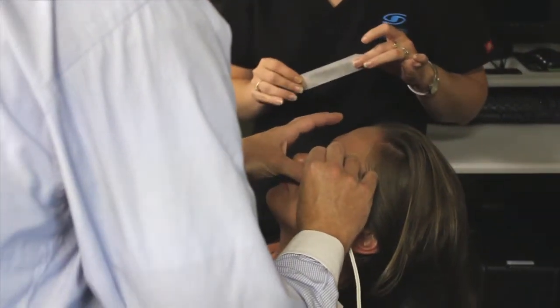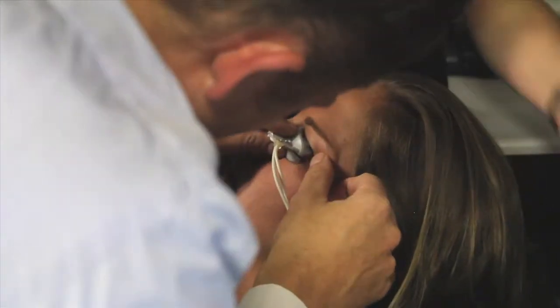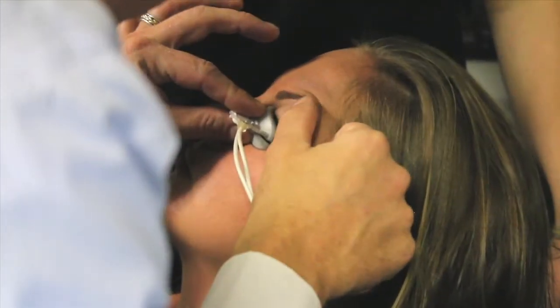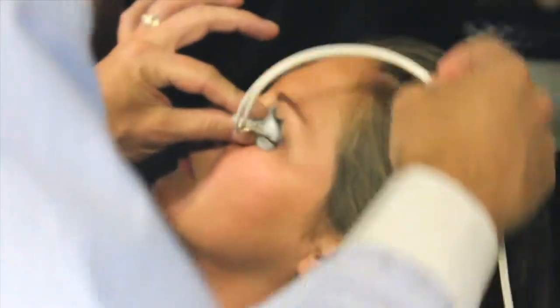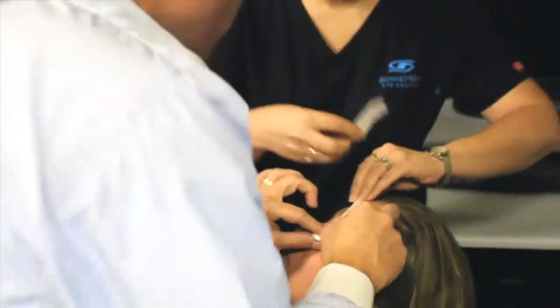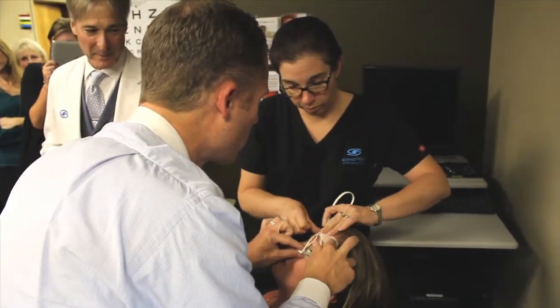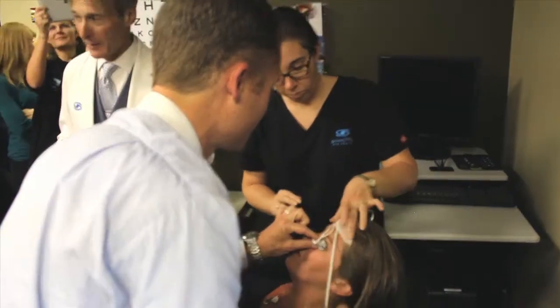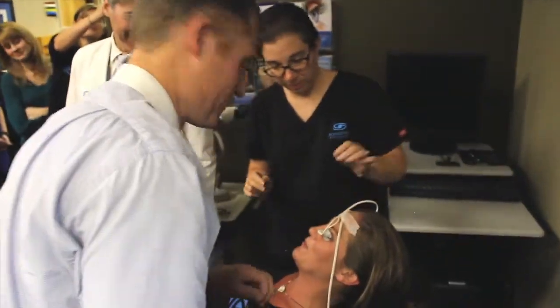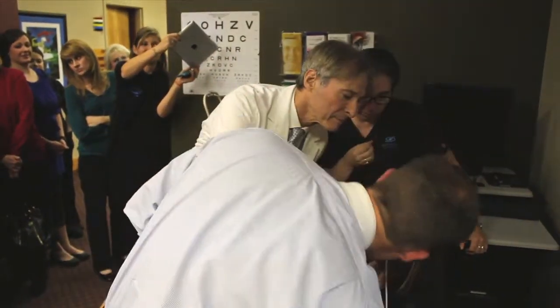You can watch in the office. You see, now it's totally in. How does it feel, Cassie? Talk as you're doing it, if you don't mind. No, it doesn't hurt. You're supposed to say it feels great. I mean, putting it in does not hurt. It doesn't feel great, I haven't gotten to that point yet. Is it in? Yeah.